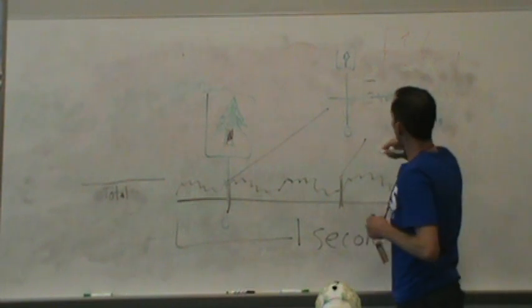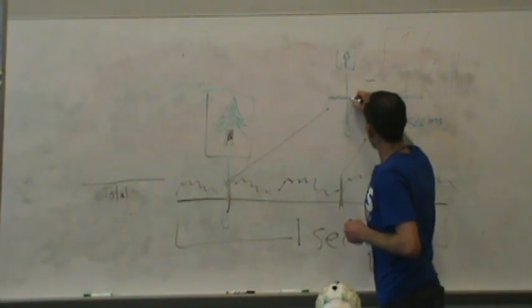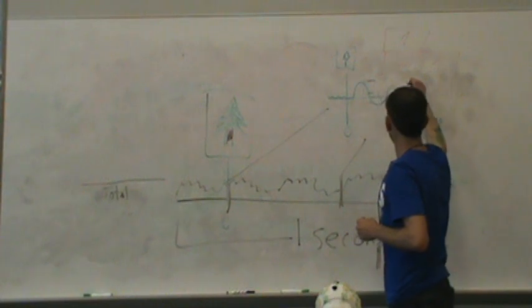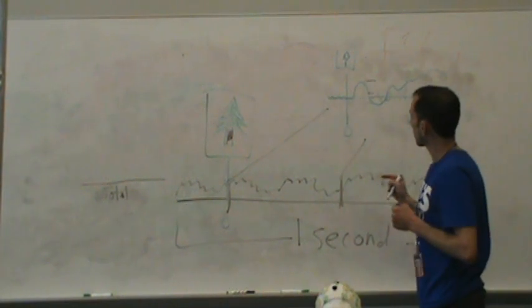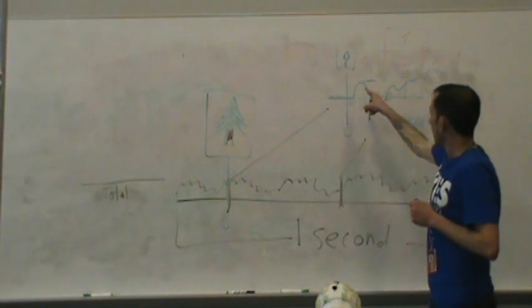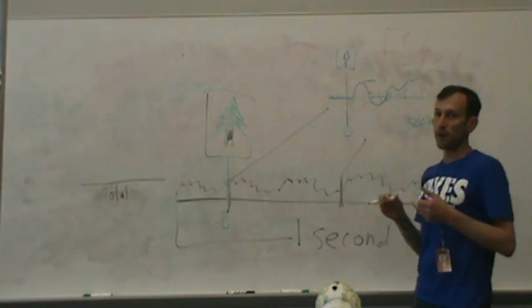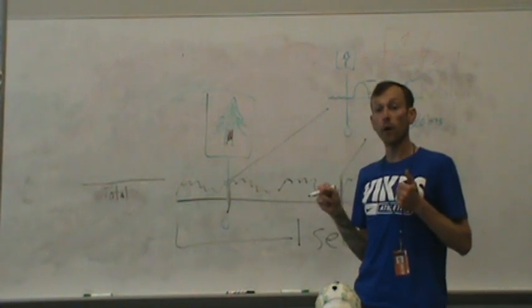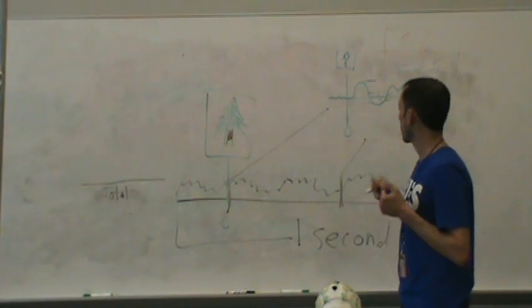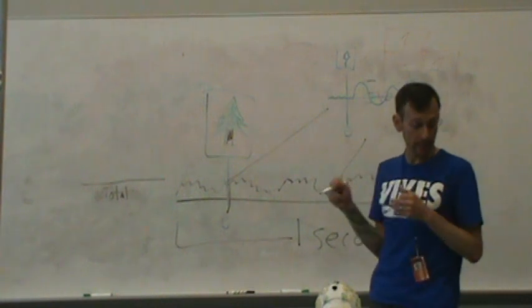And what we're going to notice are some specific crests and troughs in the EEG signal. Each of these little crests and troughs, or humps, are known as components, or event-related potential components, to be specific.